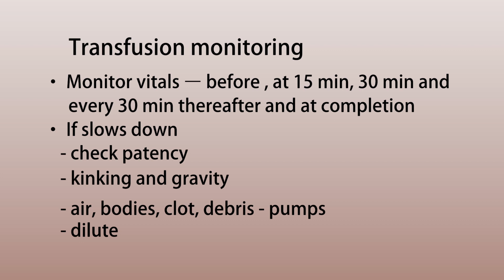So always start the transfusion very slowly, maybe at the rate of 1 ml or 2 ml per minute initially for the first 15 minutes. Again monitor the vitals. Ideally it has to be monitored at the 0th minute, that is at the start of transfusion, then at 15 minutes and 30 minutes, and every 30 minutes thereafter till completion.